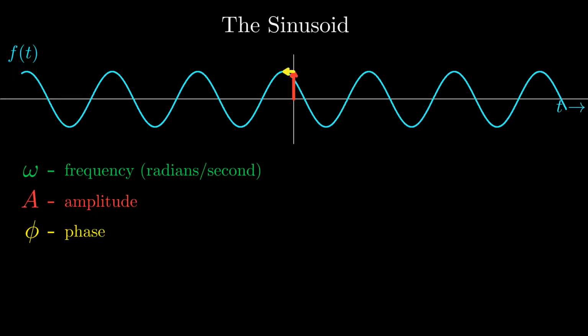How do I know? Because the sinusoid function has an explicit mathematical form. And perhaps you can already anticipate what that form is. Now the frequency omega can be any real number, and so has a range of -infinity to infinity. But note that the amplitude is any positive real number, and phase is any number between -pi and pi since the sinusoid repeats itself every 2 pi radians. Sure, you could have negative amplitudes, but that would be redundant here since a phase shift of pi would accomplish the same thing, so we'll stick with only positive amplitudes.